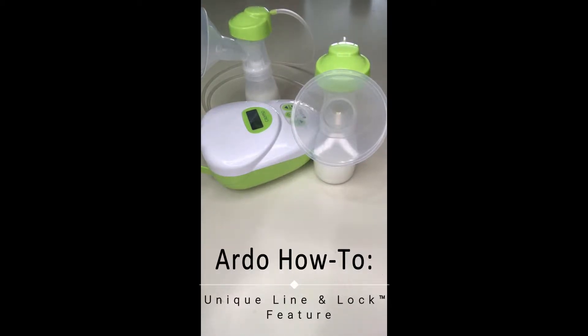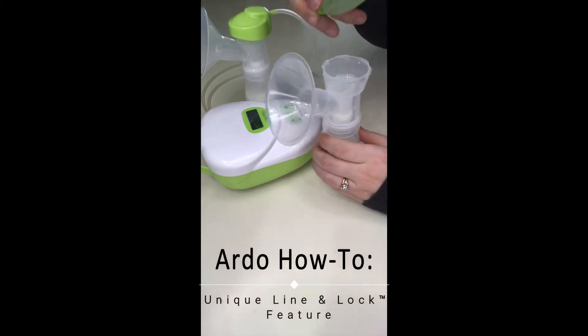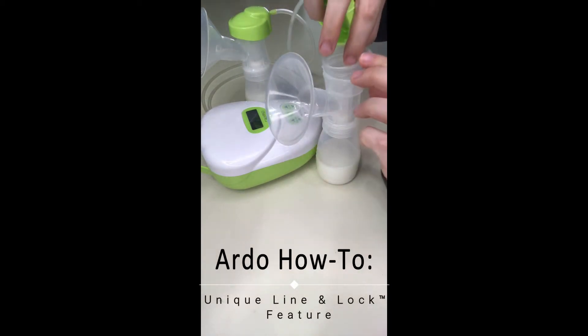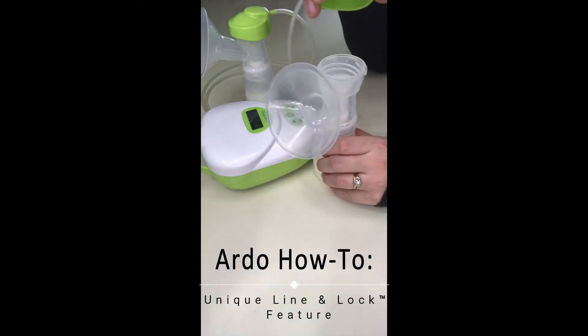In this video we're going to go over Ardo's unique line and lock feature. In the top of your pump set there is a silicone membrane pot that needs to be inserted in the top of the flange and gently tapped down with the threading on the inside.